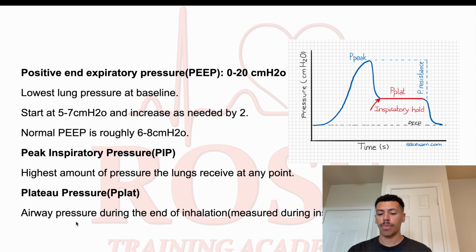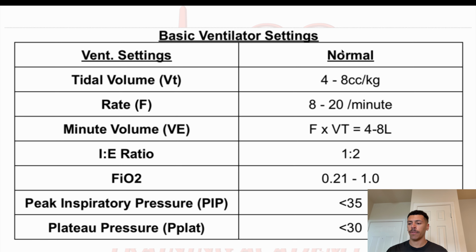This is going to be airway pressure during the end of inhalation, measured during an inspiratory hold. And so you take your deep breath in, you don't hold it all, you let just a little bit out, get your P-plat, and then you exhale. And that's it. So some more basic ventilator settings.